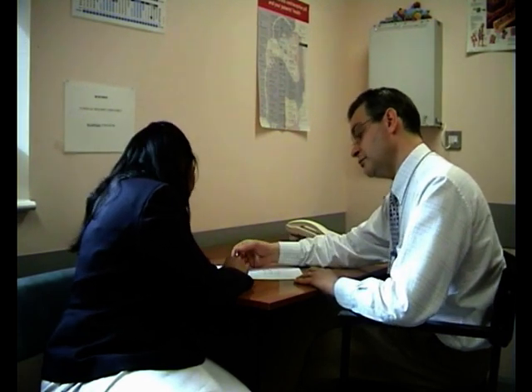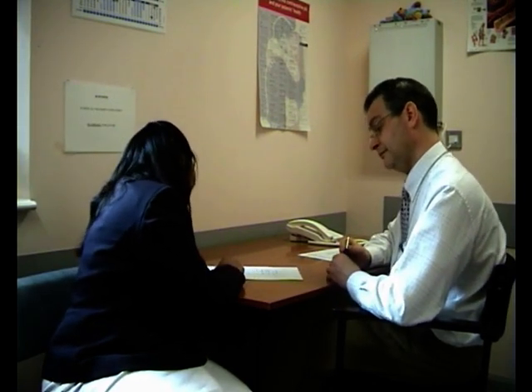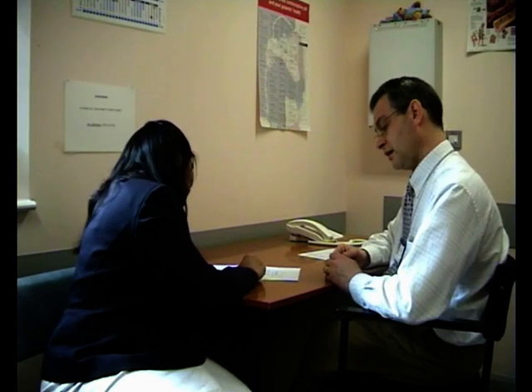But is there something else that's important to know about that void? How much she voided. What is the volume, and how much do you think she voided? Almost nothing. Is this meaningful? No, not really. Okay, that's good. So I would also like to know the residual. There was no residual. And then they put in about 333 mils. Do you know at what rate that's filled? It's usually 50 mils per minute.